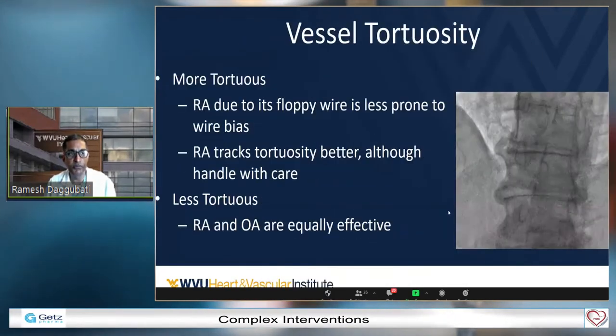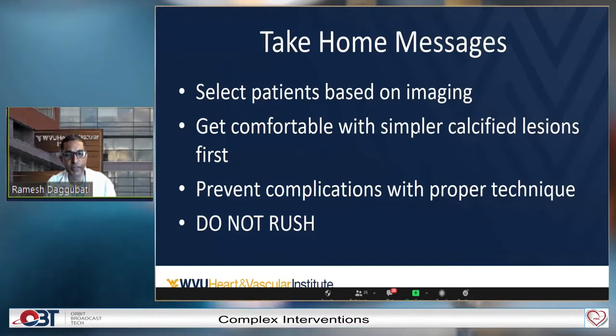So, more take-home message. Select the patients based on imaging. Get comfortable with simpler calcified lesions. Prevent complications with proper technique. And do not rush while doing a rota.